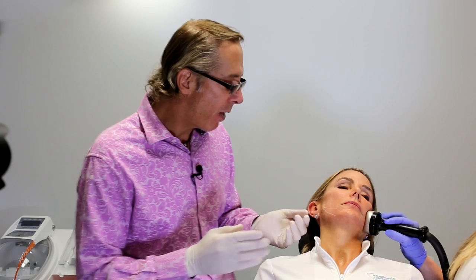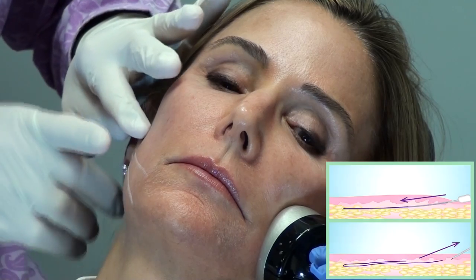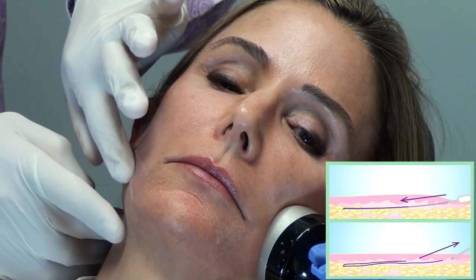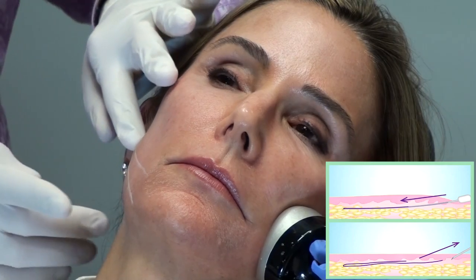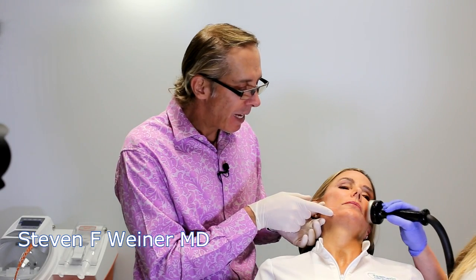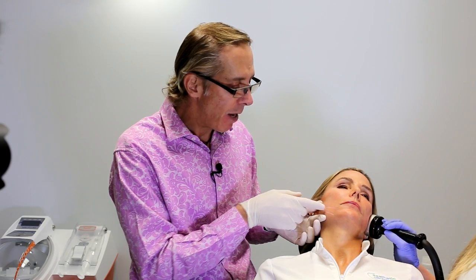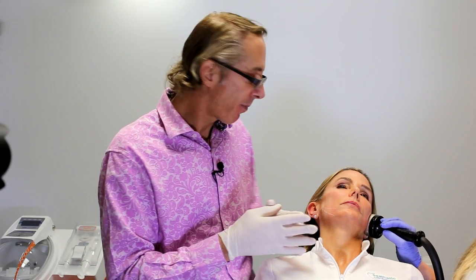So what you do is for the barbed threads, you numb the skin a little bit, and I'll show you how to do this, and then you insert it, and then you gently retract on the skin, and that causes the barbs to be engaged. In this area, the smooth threads, you just insert like in a crisscross fashion or hashtag fashion, and over time, the body reacts to these sutures by creating collagen. So you can almost imagine that this creates almost like a tendon of collagen that lifts this corner of the mouth and marionette area. The results last for 12 to 18 months, and then they need to be redone.